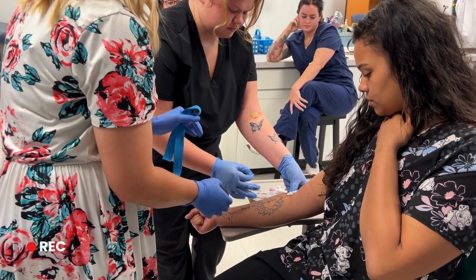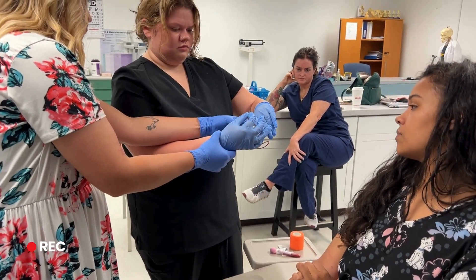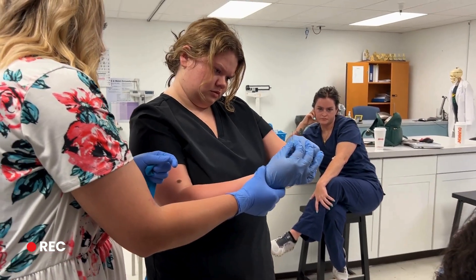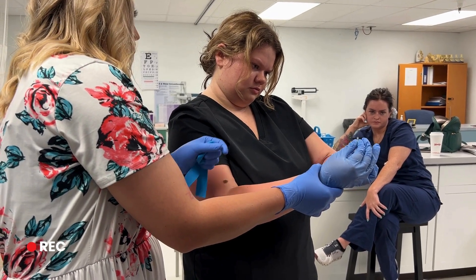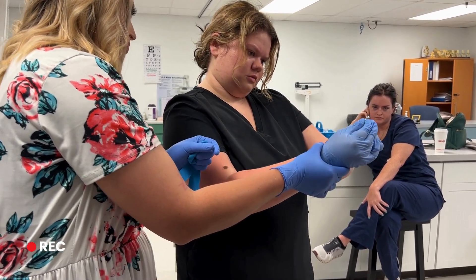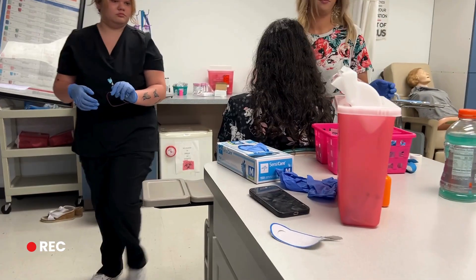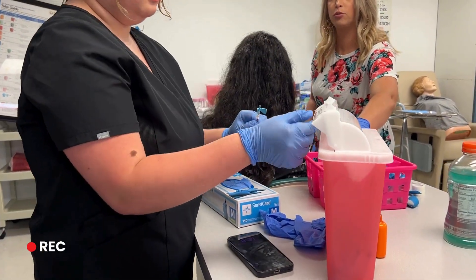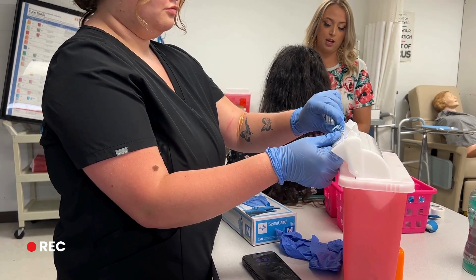Perfect. Now watch this — have her hold that. You're gonna grab your two little squeeze things right there. Pull up at the bottom — there you go. Pull up with the blue, squeeze it — it pulls. Pull it all the way up.